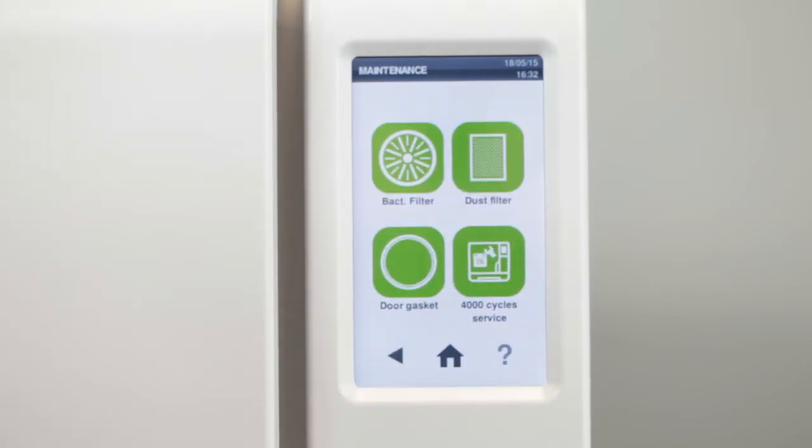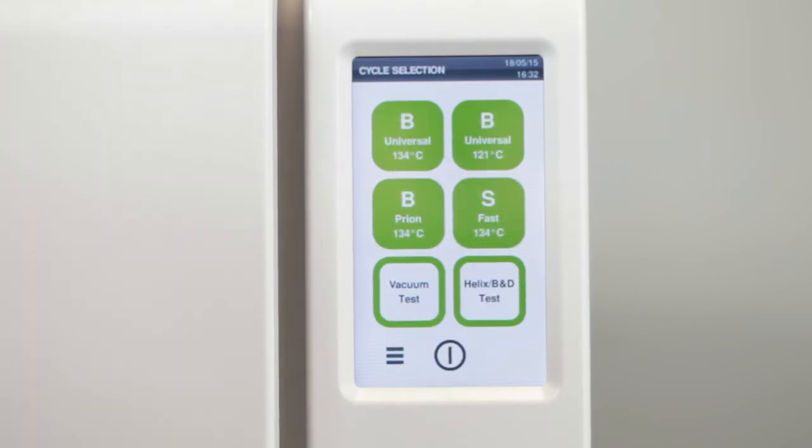Return to cycle selection to ensure that your Lisa sterilizer is ready for normal operation again.